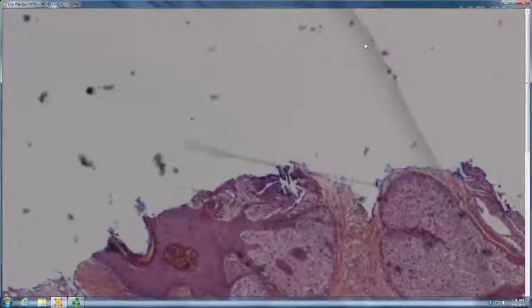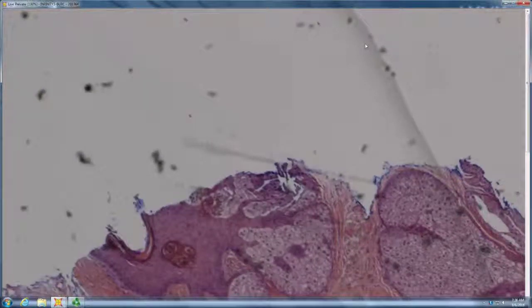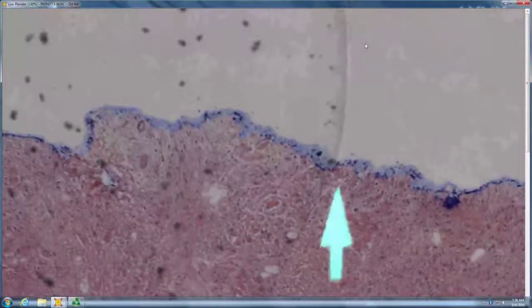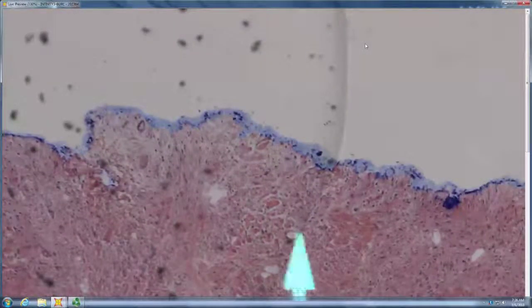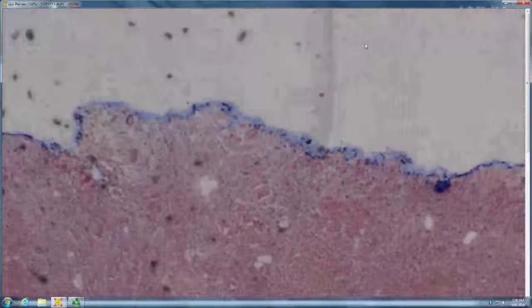A little shave biopsy in the center. Sebaceous gland. Yeah, so you have kind of a hair follicle with big sebaceous units hanging off it, and then you have a lot of stroma around that. So the follicular sebaceous cystic hamartoma. Yeah, exactly.